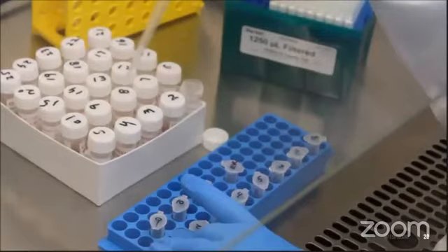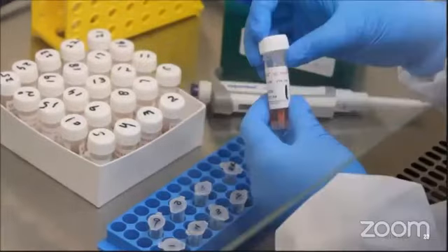Care should be taken during the addition of the samples into the Eppendorf tube.